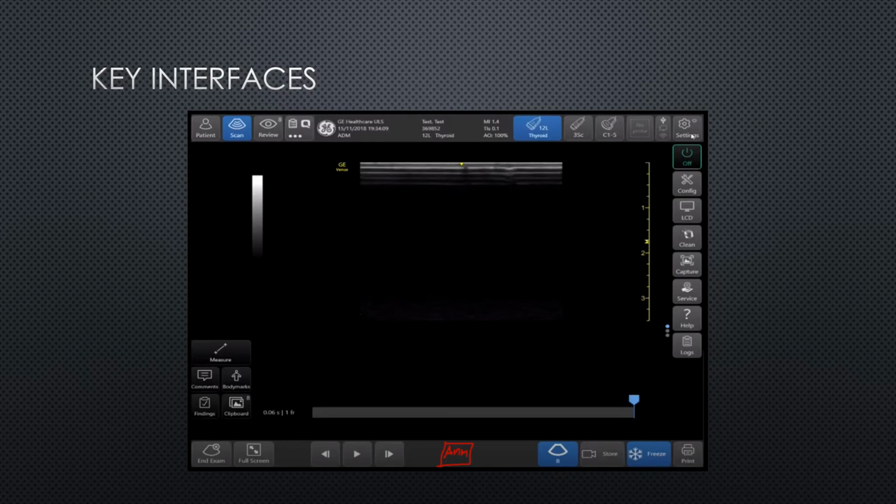So say this is a cardiac exam instead, and you have a heart that is lopsided, so you want to do an EPSS, but the valve is over like this, right? If you try to do an M mode from here, you're going to end up getting a way artificially elevated M mode measurement right here.